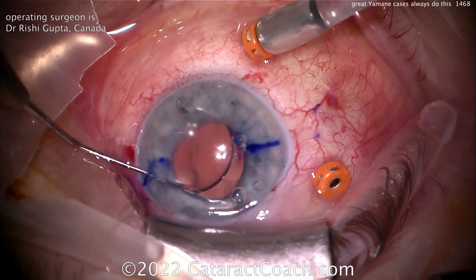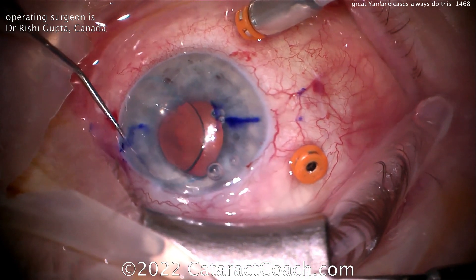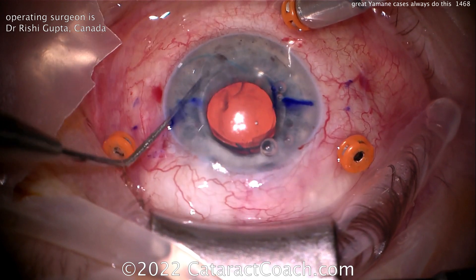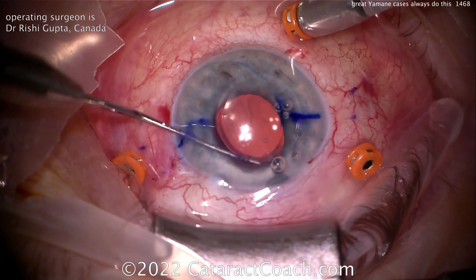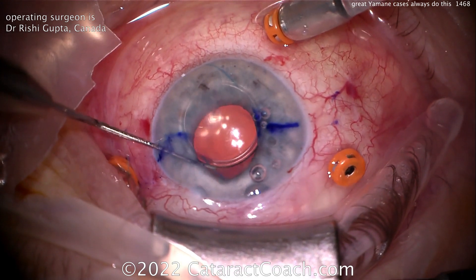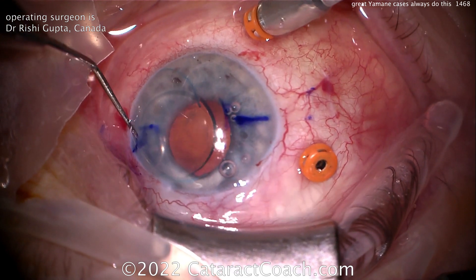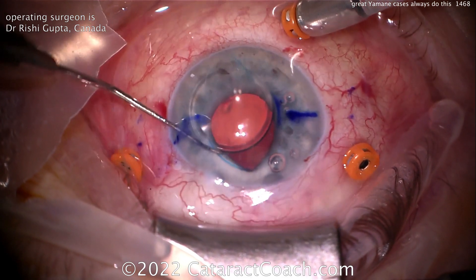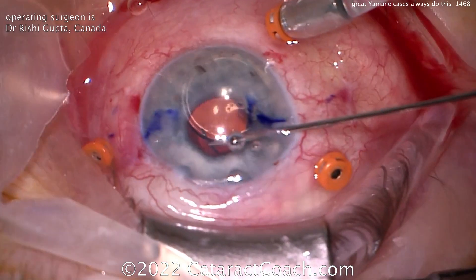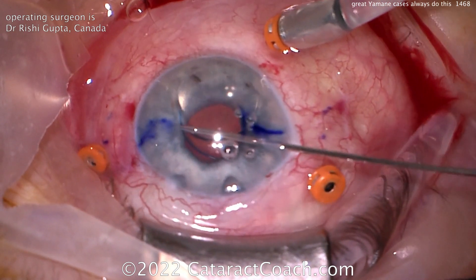Here's the thing he does that's so critically important — look carefully. This lens is coming up and being explanted. The haptic is broken, and this patient already had one attempt at a Yamane procedure. You can see there's a bit of a haptic stuck at the right side of the screen — it's stuck in the intrascleral pocket. He's trying to free it up, and now he's going to have to try a different technique, maybe going with forceps to get a better grip and pull it through.